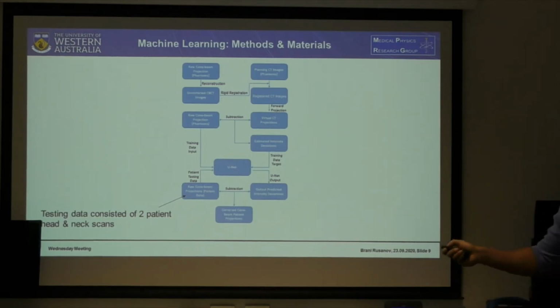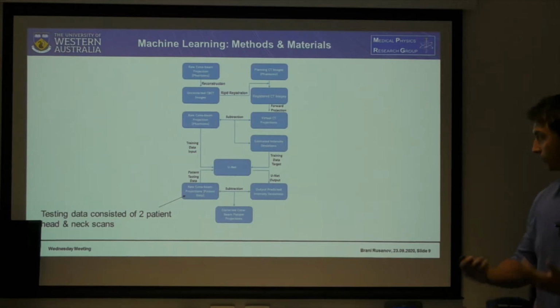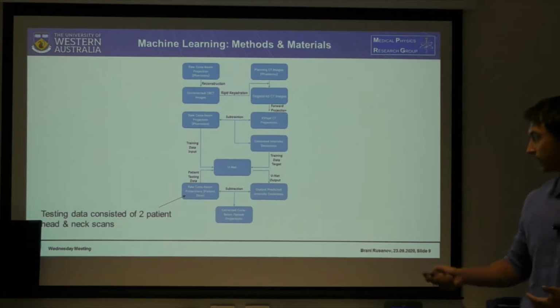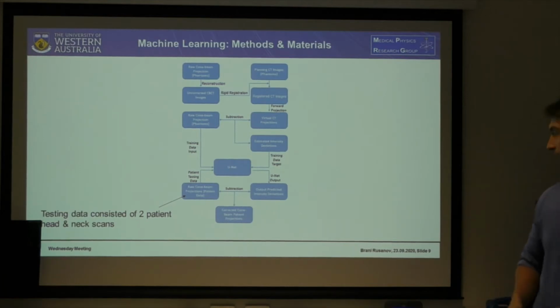And now we introduce a machine learning architecture called a UNet, which came out in 2015, and it's specialized in medical image segmentation as well as using small data sets, but it's been modified to work with regression instead of classification kinds of problems, because here I'm predicting real world values instead of ones and zeros, which is what a classification task is.